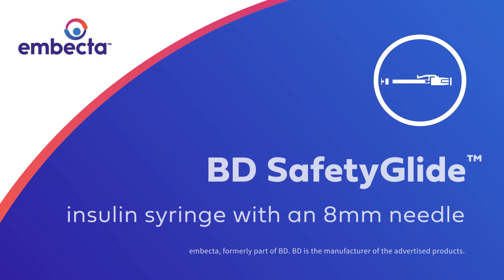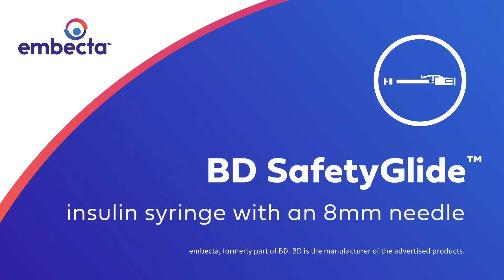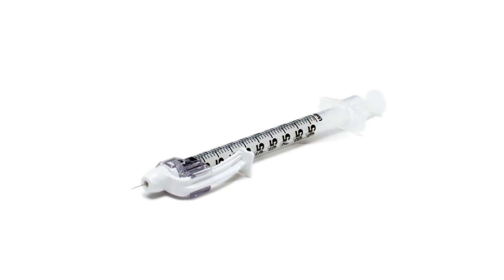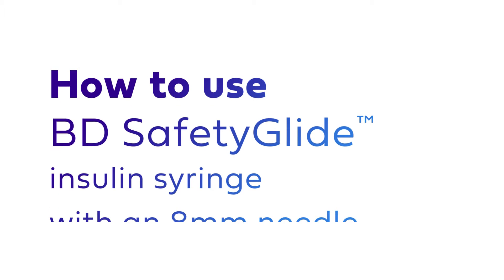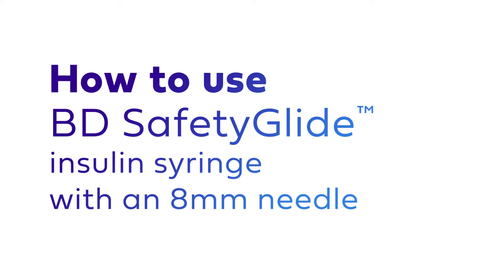The BD SafetyGlide Insulin Syringe with an 8mm needle features a one-handed safety mechanism to help protect healthcare professionals and caregivers from accidental needle stick injuries. Let's review how to properly use the BD SafetyGlide Insulin Syringe with an 8mm needle.